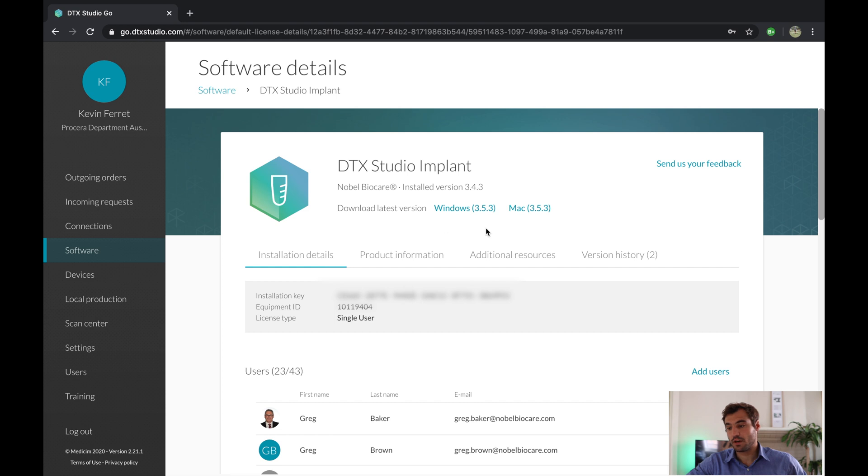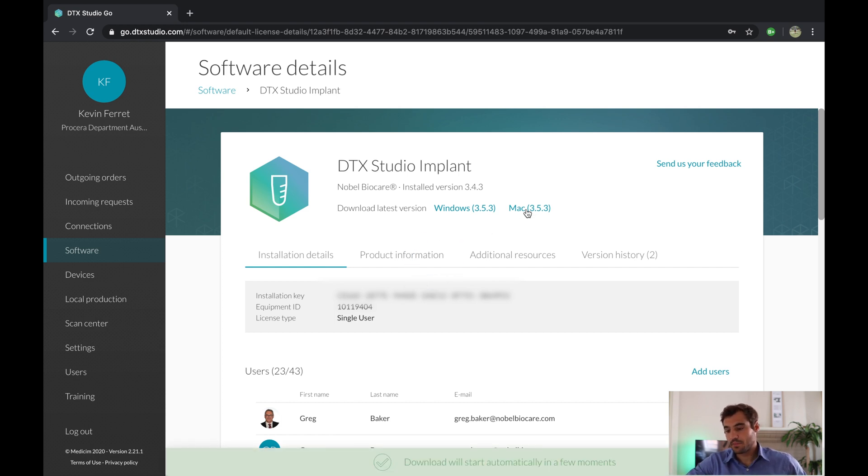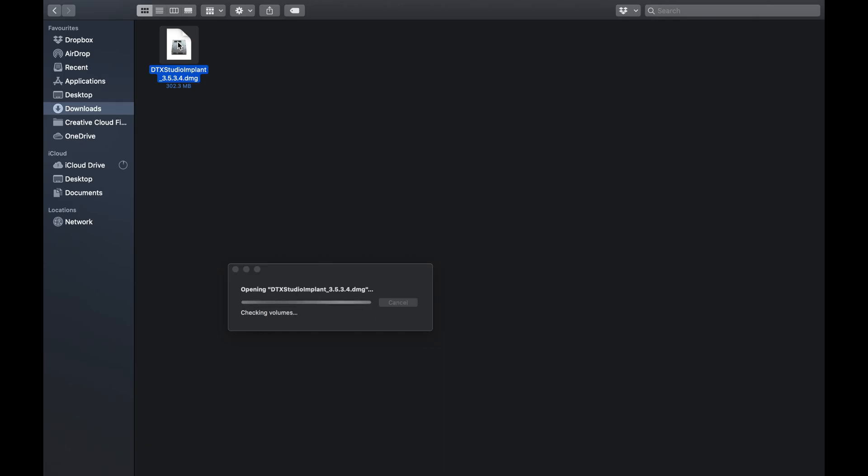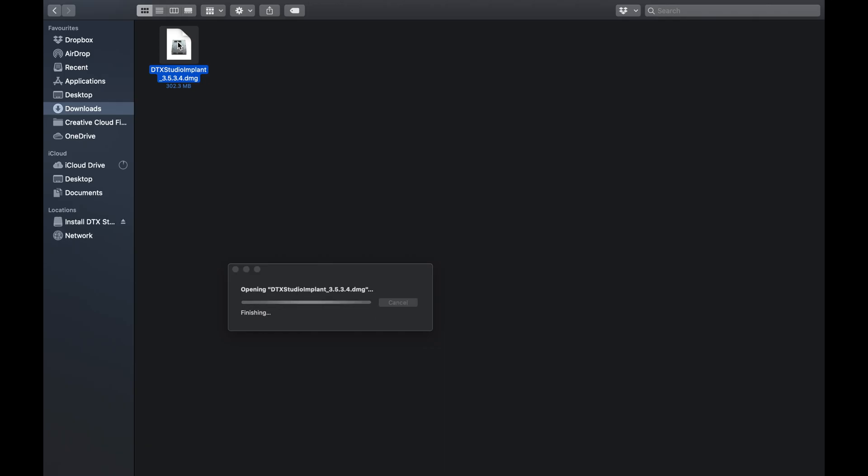Simply click on Mac or Windows for my case, and the installation will start. Alright, so once this is downloaded, just head to your download folder, double click on the file.